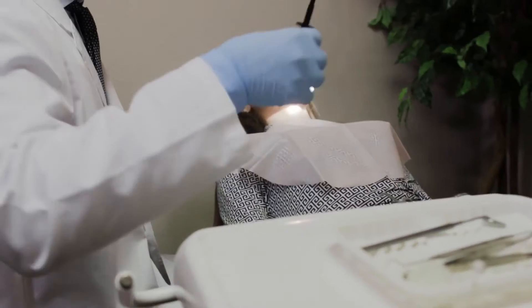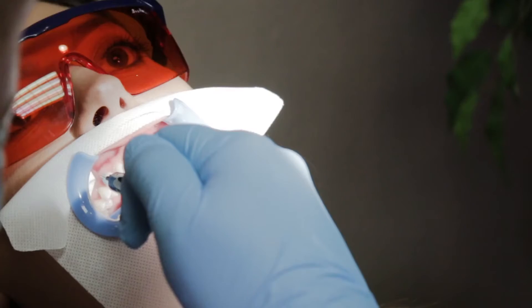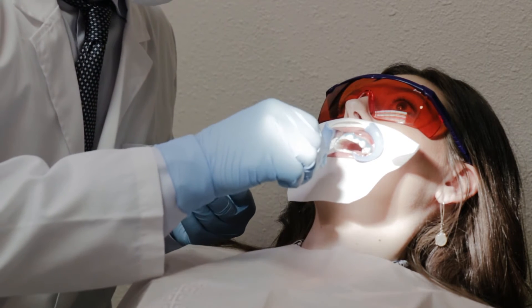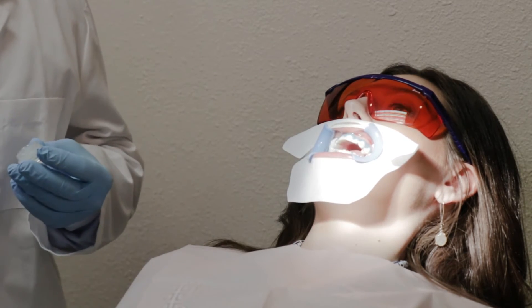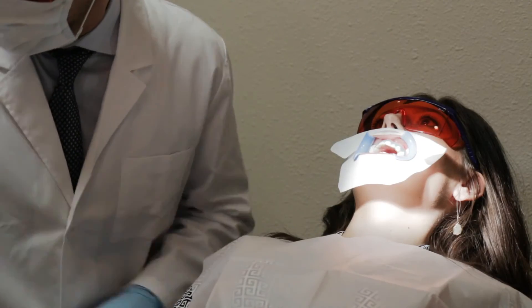Holding the syringe at a 45 degree angle to the tooth surface, apply a 2 to 3 millimeter layer of Beyond BlueSeal gingival protection along the gingival margin. Apply extra lip protection along the inside of the upper and lower lips. Remove the LED curing light from the back of the machine and hold it 0.5 to 1 centimeter away from the gingival.